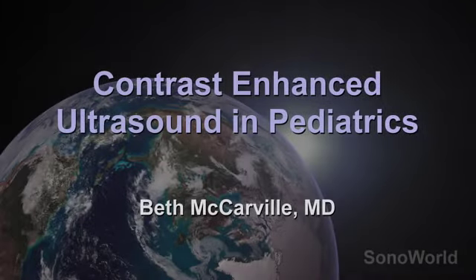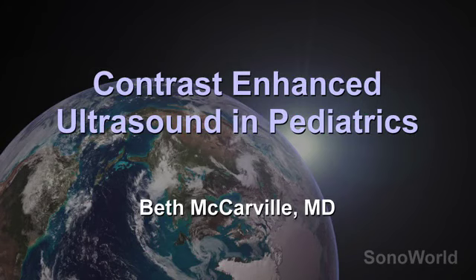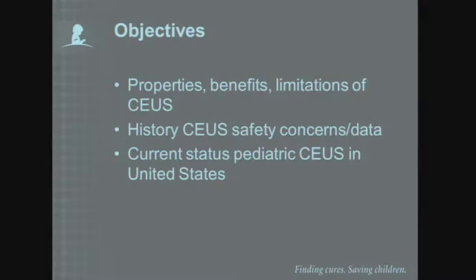And today I'm going to be talking about contrast-enhanced ultrasound in pediatrics. The objectives of today's talk include a discussion of the properties, benefits, and limitations of contrast-enhanced ultrasound, and especially as they apply to the pediatric population.